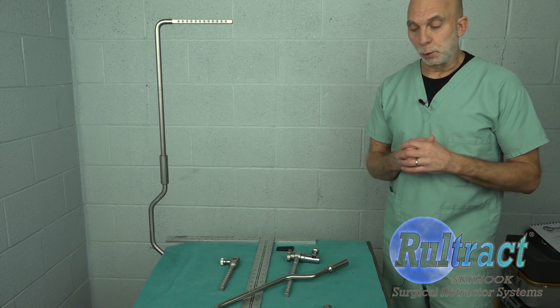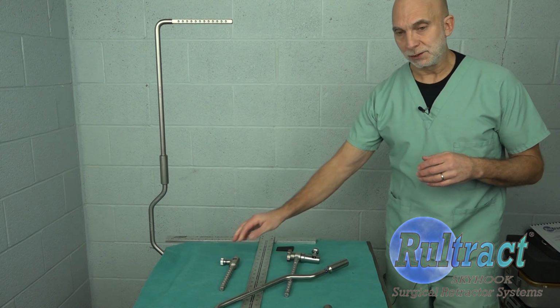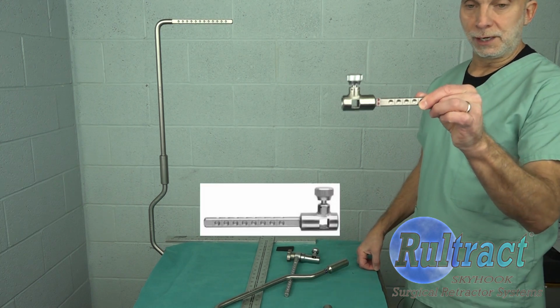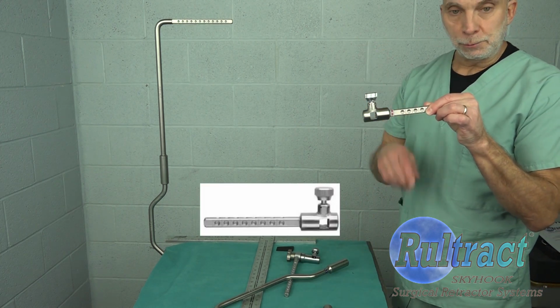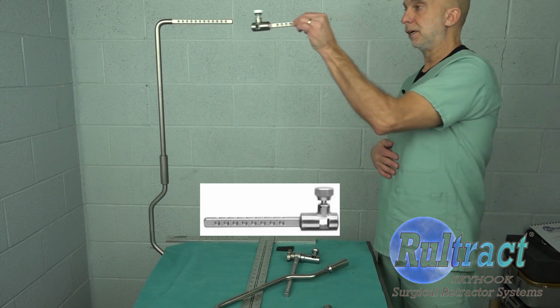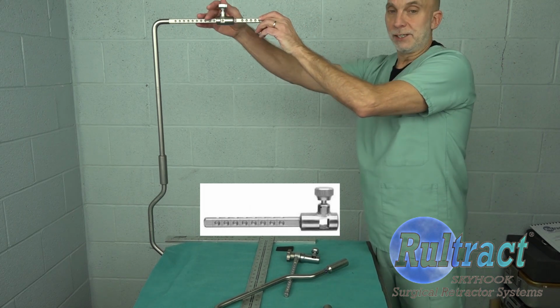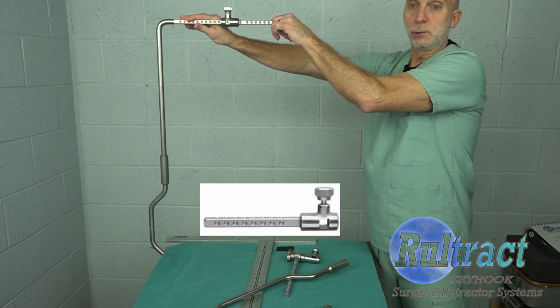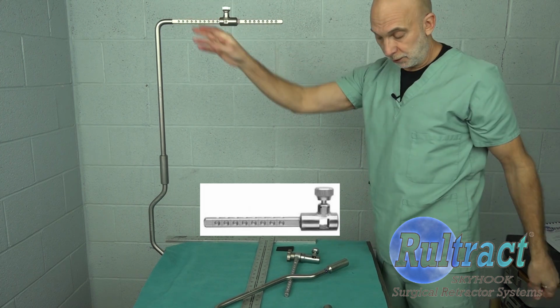So one of the most important things to do is to be sure that your extender bar is put on and locked into position. So we're going to open that lock knob all the way, slide it all the way over, and then tighten the lock knob down. Make sure that it's securely attached.